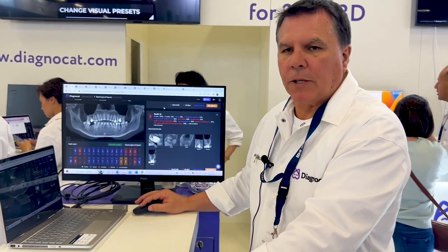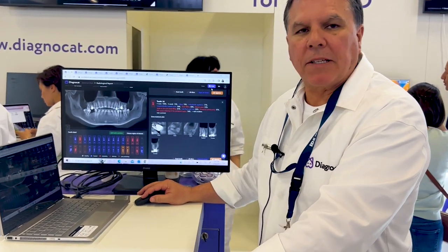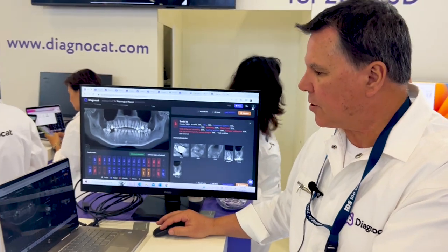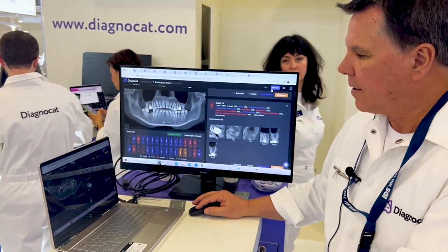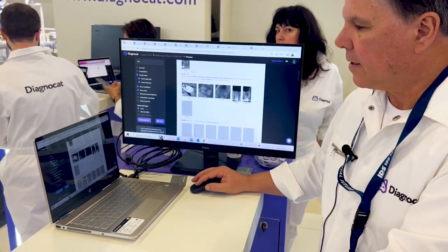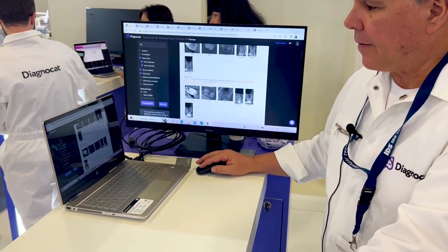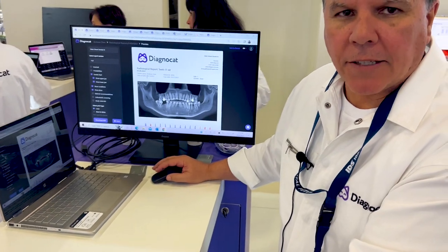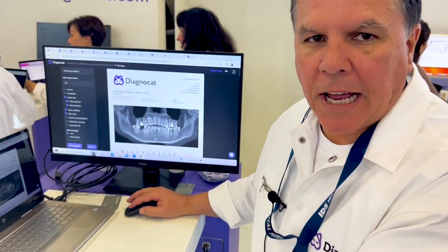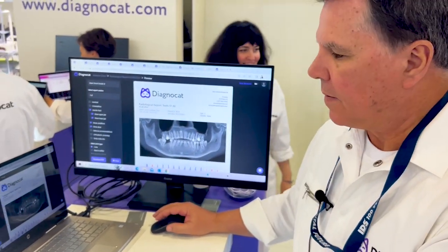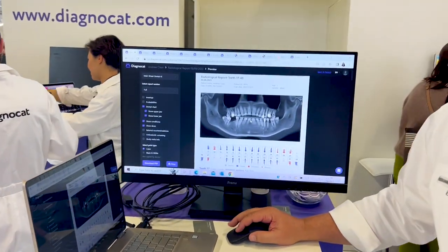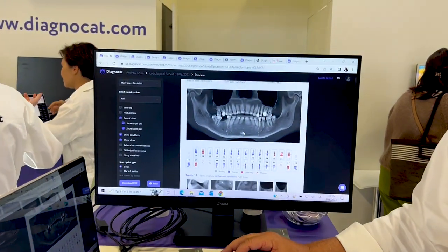It also prints a report that makes it nice and convenient for you and your patients. It has details, has your contact information, has your logo, and has all the details of the treatment plan that was just presented.